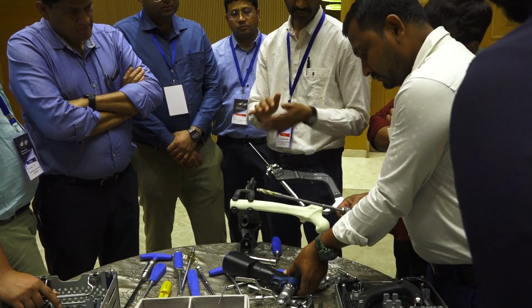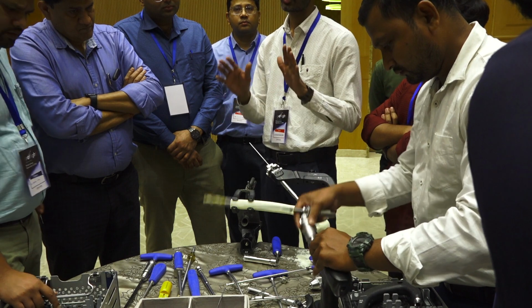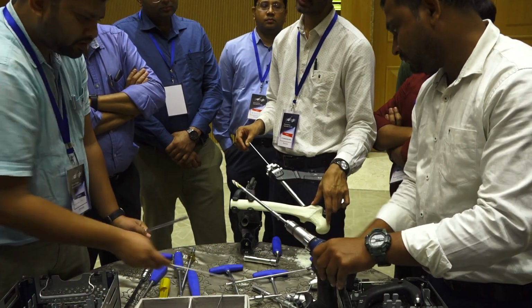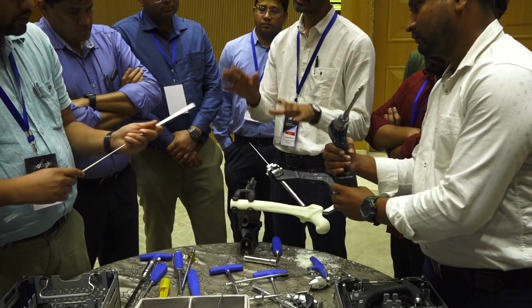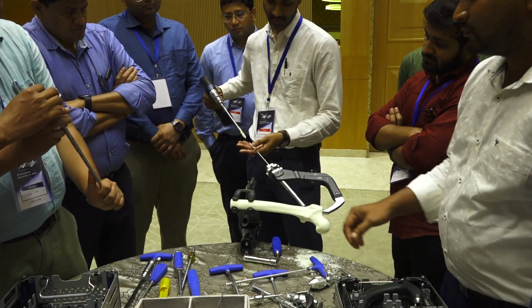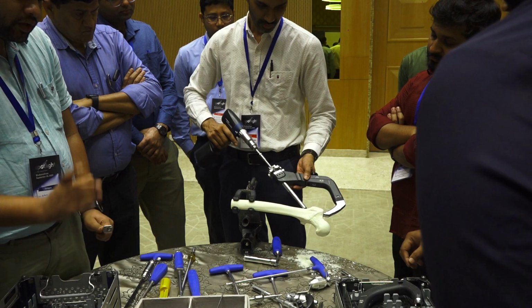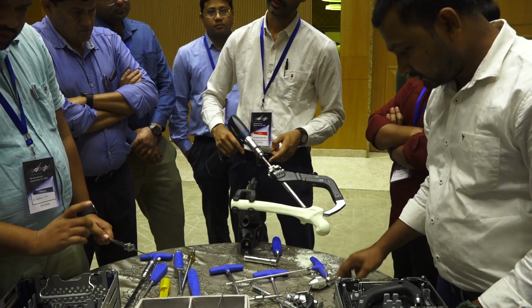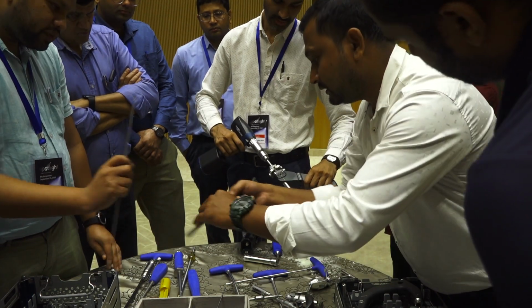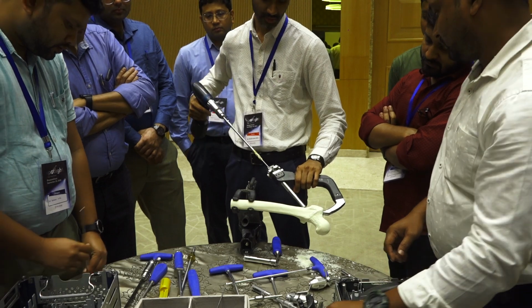There is a perforator for breaking the outer cortex. If it is an osteoporotic bone, you just break the outer cortex and then take the proper size of helical blade and hammer it. If it is a hard bone, you have to ream throughout. This is for perforating the outer cortex. It also has a stopper here, so it will go only that much distance. Under C-arm you have to check, and this will stop here. This is just to perforate the outer cortex.